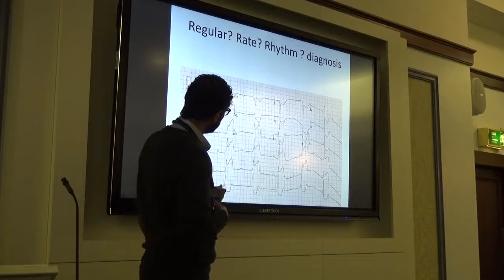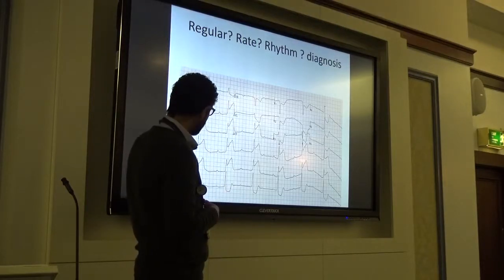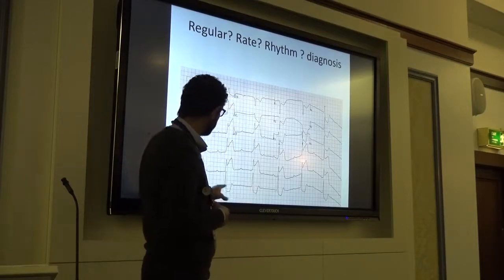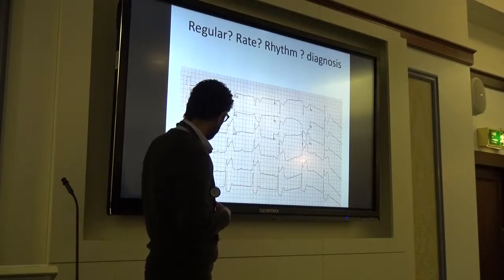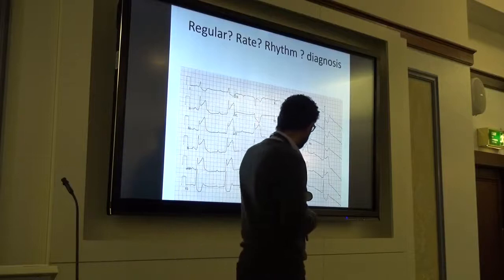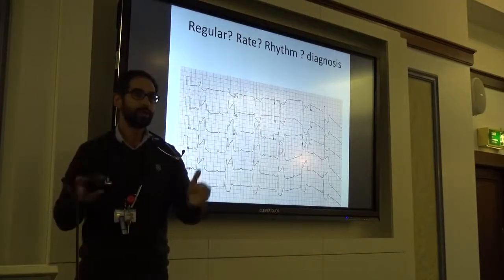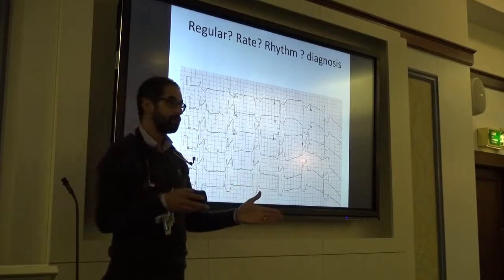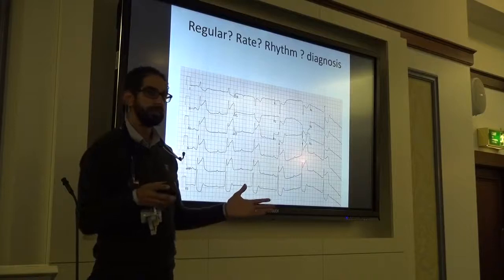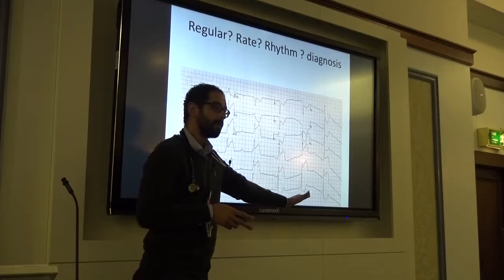AV node, possibly AV node, because I can see here perhaps PQRS, but then I lose completely the relationship. Yeah, so the P wave is here, another P wave is here, another P wave here, P wave, P wave, P wave. So the P waves are working, so the sinus node is working here. Okay, so the sinus node is firing, but the QRSs, the ventricle, are completely out of sync. The QRS are just doing their own thing. Yeah? Can you guys see that?